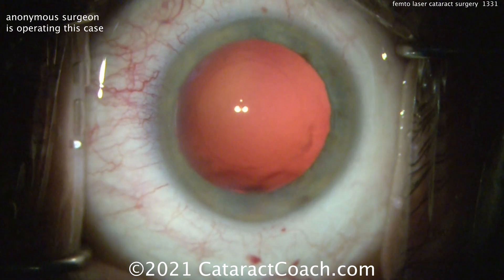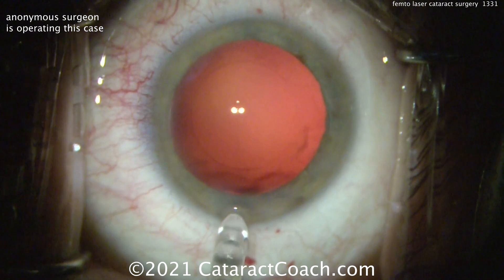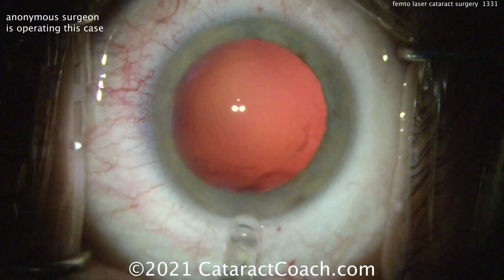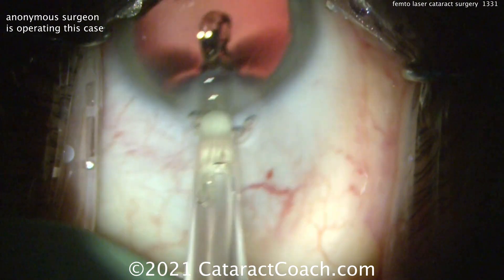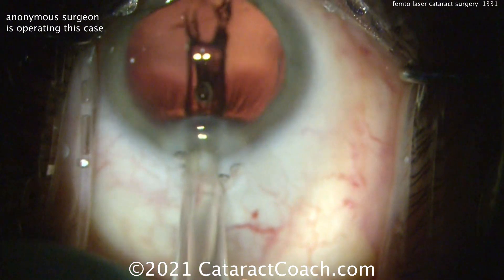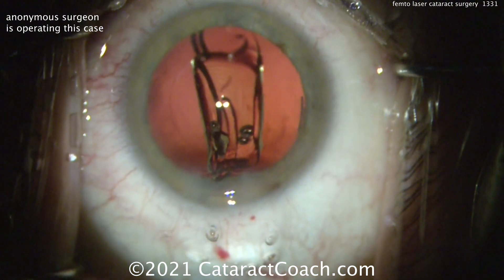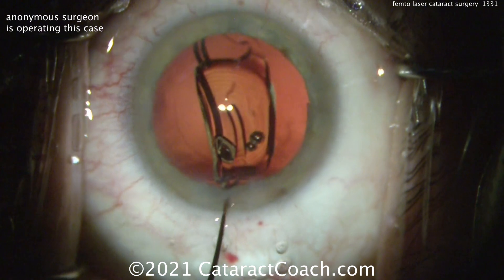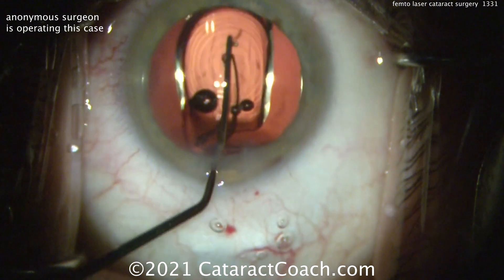The only difference that a recent study showed between femtosecond laser and non-laser phaco surgery was that for astigmatic treatments it was a little bit more accurate. I can understand that. But remember, that was for a diopter or more of astigmatism. And you know what's better than any corneal incision for a diopter or more of astigmatism? A toric lens. So it's not really much of a point.